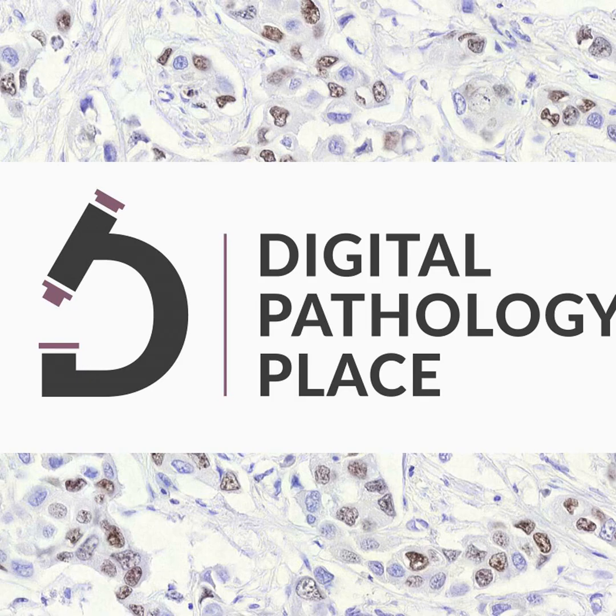And I would say that one of the large unmet needs today is standardization in the application of tissue diagnostic assays. And standardization is in two areas. It's in staining and it's in interpretation. And if you look at where image analysis and the entire AI field goes today, the focus is really on the interpretation aspect, which is, of course, extremely important when we are looking at increasingly complex tissue biomarkers for companion diagnostics, for example. But the lack of standardization when it comes to management of stain quality is really significant. For some tissue biomarkers, the external quality assessment organizations like CAP, Nordic QC, and UK NEQAS are still reporting failure rates as high as 30% for routine diagnostic pathology labs in their proficiency testing programs.